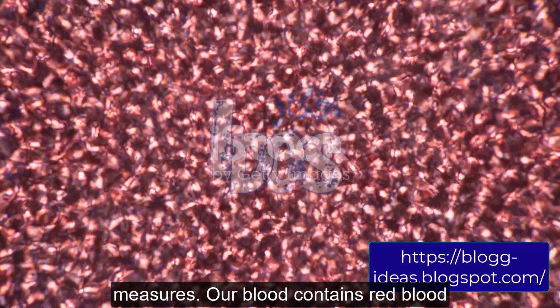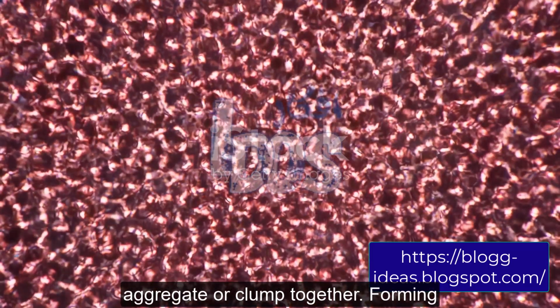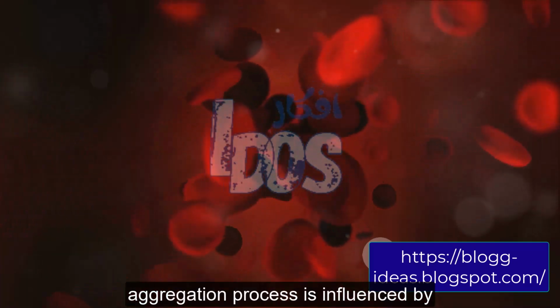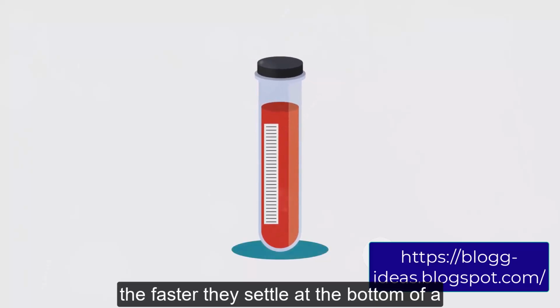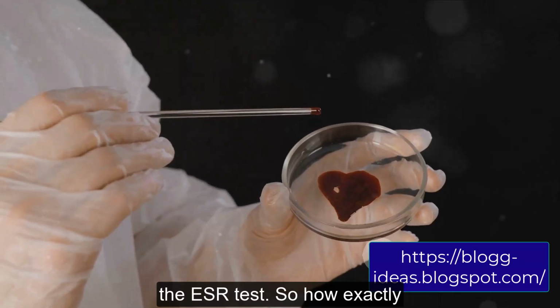Our blood contains red blood cells which, under certain conditions, aggregate or clump together, forming clusters known as rouleaux. This aggregation process is influenced by blood plasma proteins, primarily fibrinogen. The more these clusters form, the faster they settle at the bottom of a tube. This phenomenon is the basis of the ESR test.